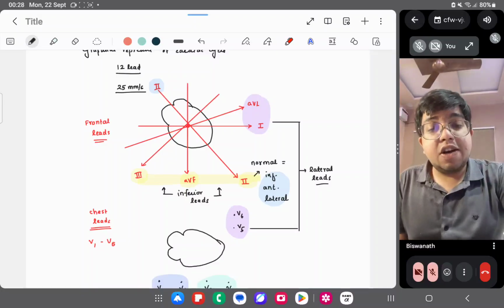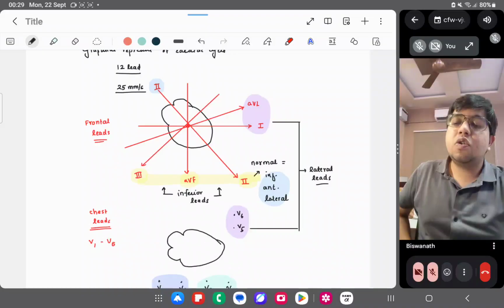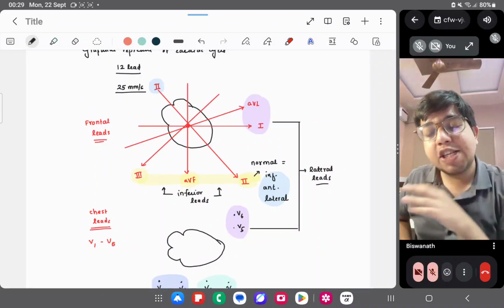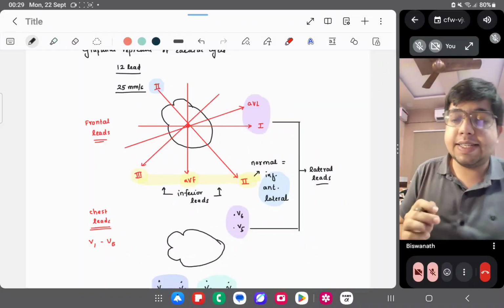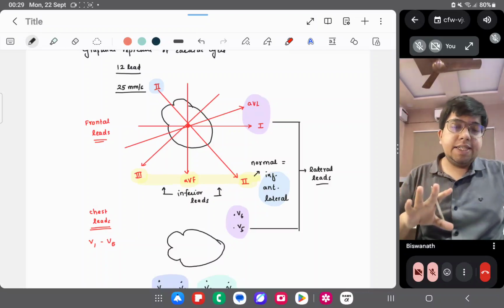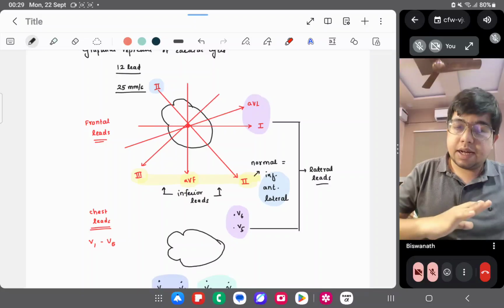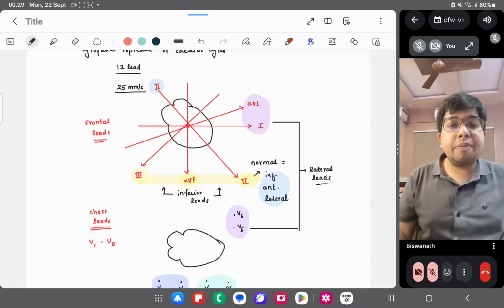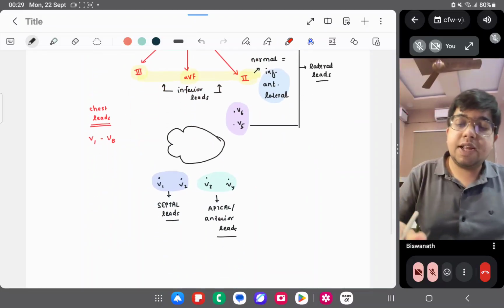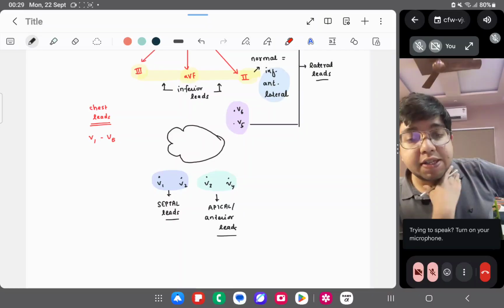Now we'll discuss a concept which is called contiguous leads. Contiguous leads are leads which are representing a specific part of the heart, like the septum of the heart. Which two leads are visualizing the septum of the heart? The visualization of the septum is done by V1 and V2. So V1 and V2 are contiguous leads.